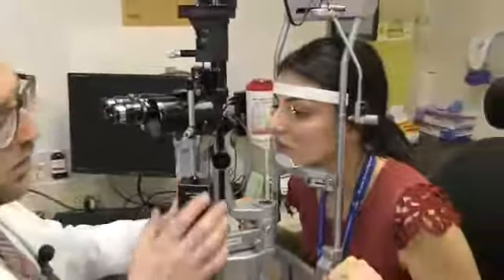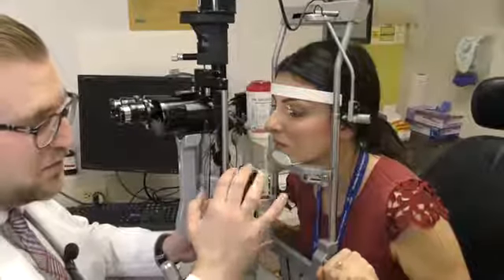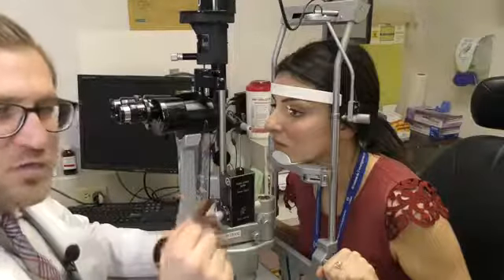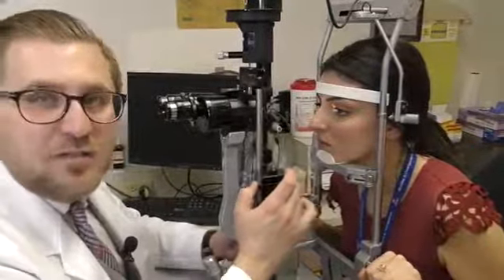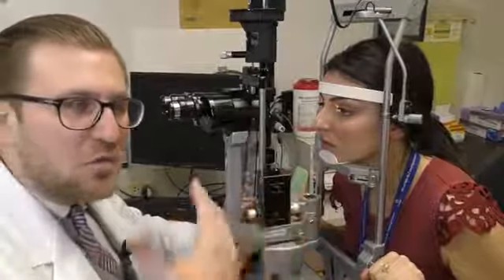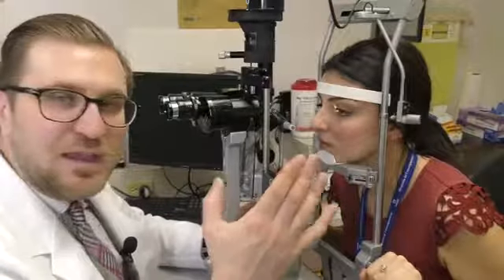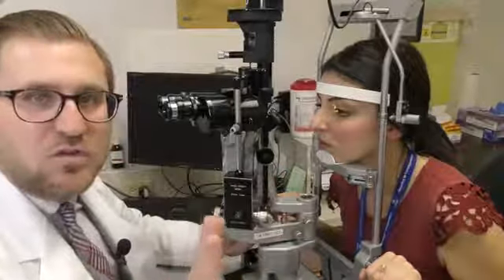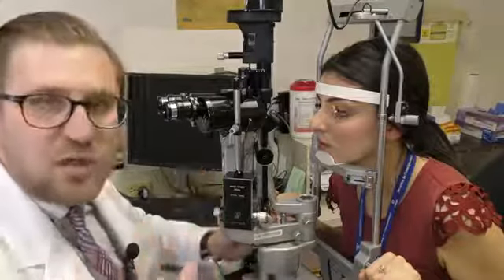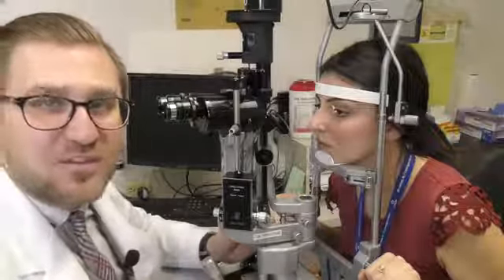Okay, always remember this here is basically our tonometer tip, our Goldmann tonometer, applanation tonometry to measure the intraocular pressure. This device is good to use for the more advanced physician. At the beginning, it's not the easiest to use, so I would just move it back, lock it here. Don't use it for now. What you can use to measure the pressure in the eye is the Tono-Pen, which we'll be showing in our subsequent videos, so soon to come.